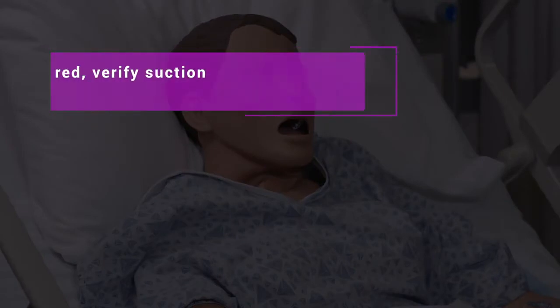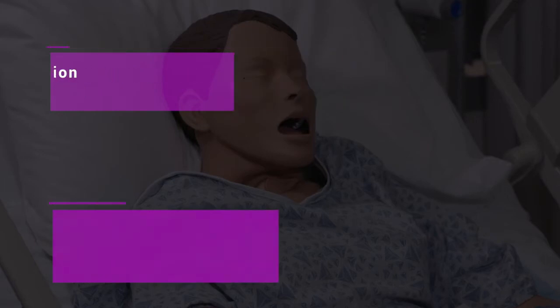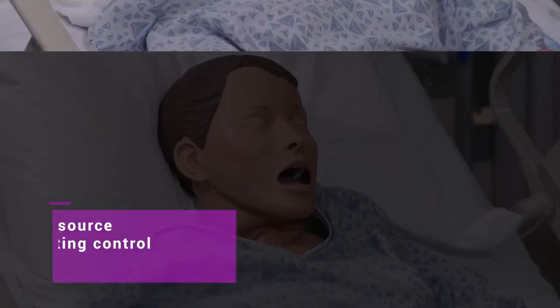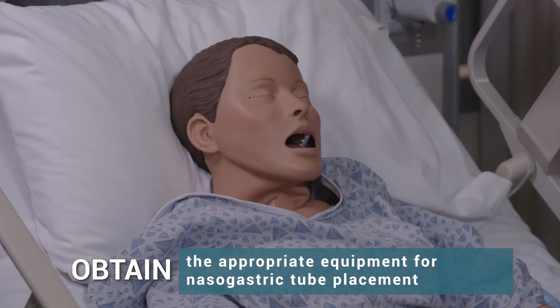If suction is ordered, verify suction source at this time. Connect suction tube to source of negative pressure, setting control per physician's order. Obtain the appropriate equipment for nasogastric tube placement.